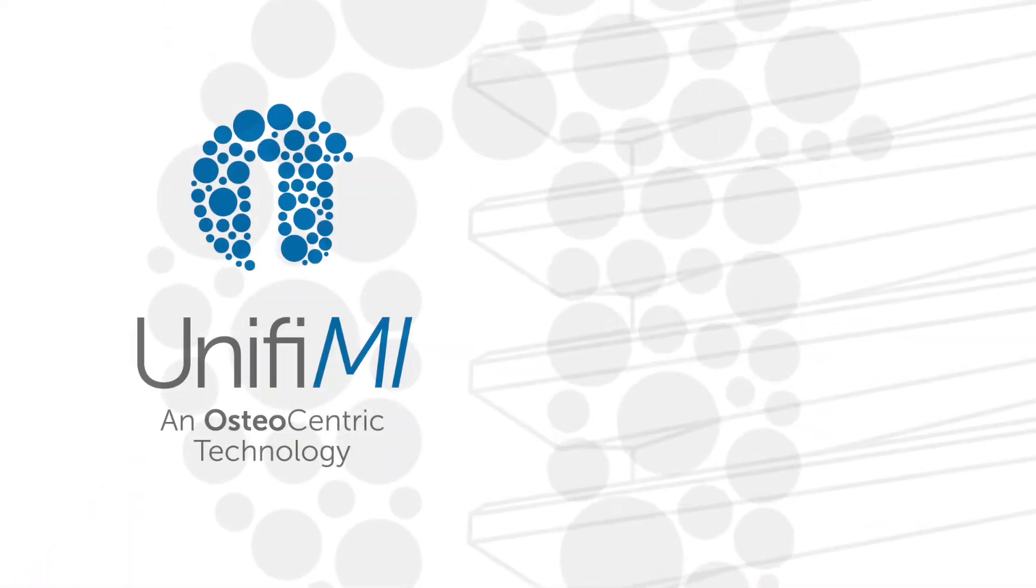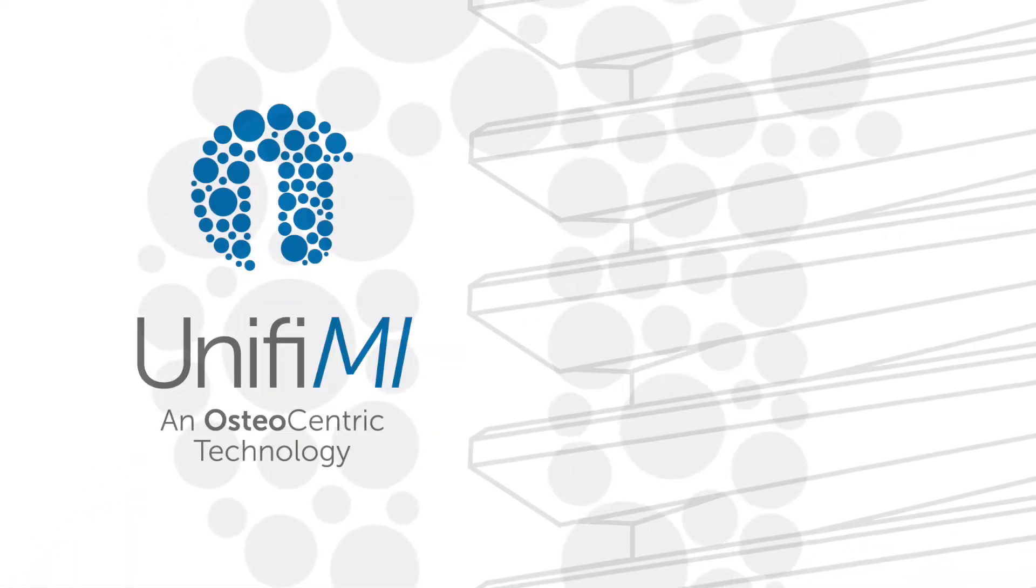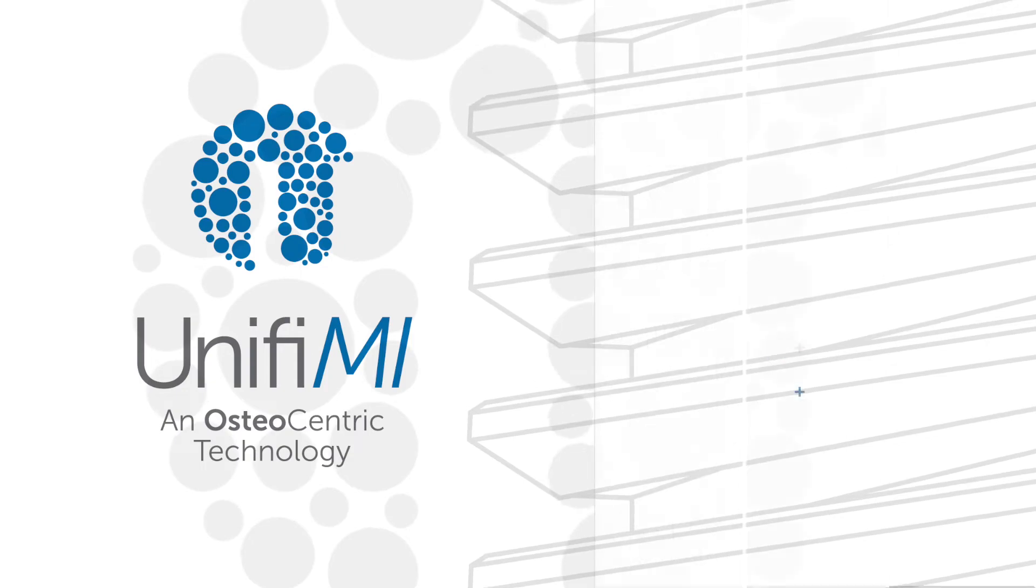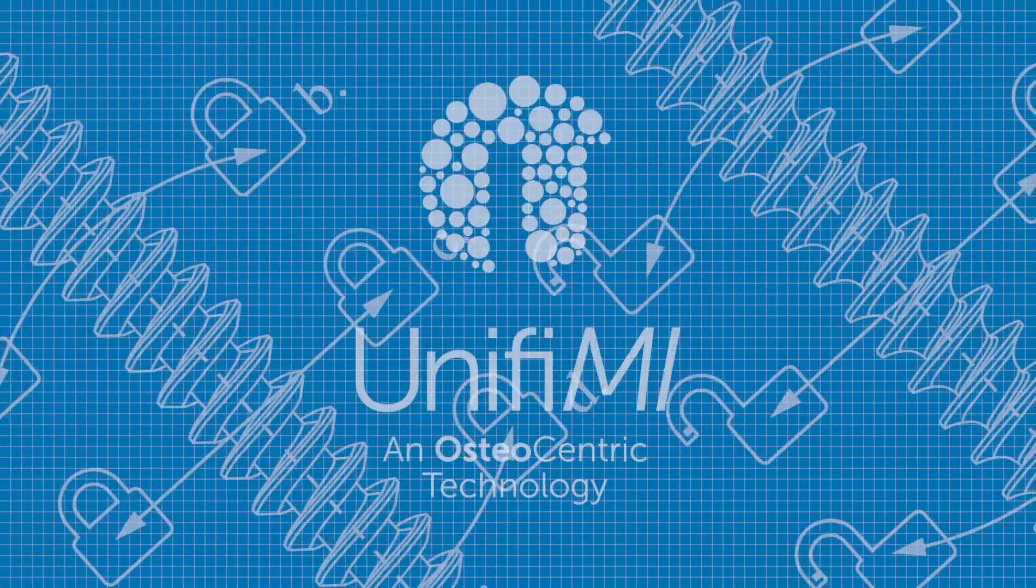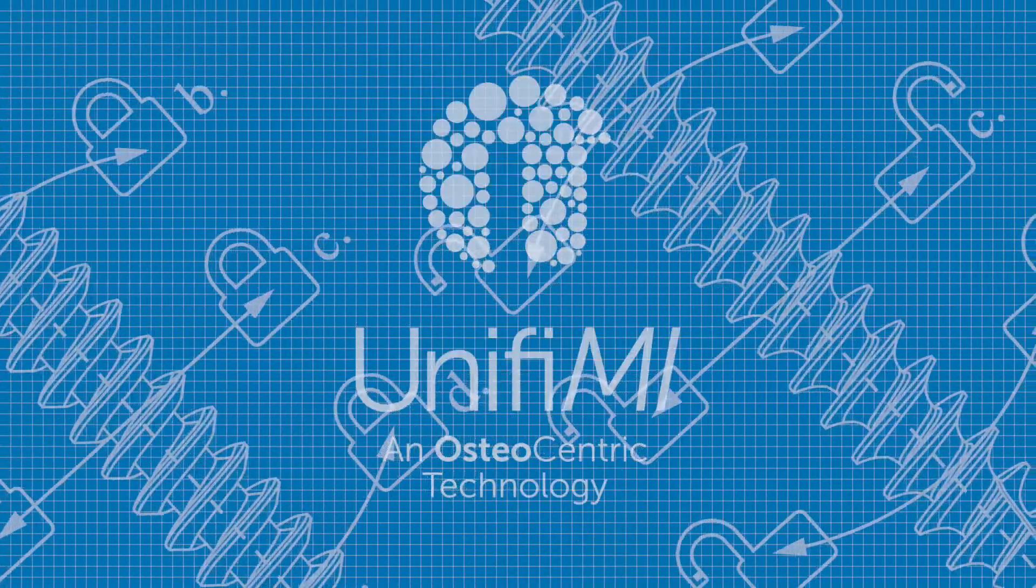To demonstrate UniFi-MI and how it improves the bone-to-implant interface, here's an example of how UniFi compares to a conventional screw in a threaded application.